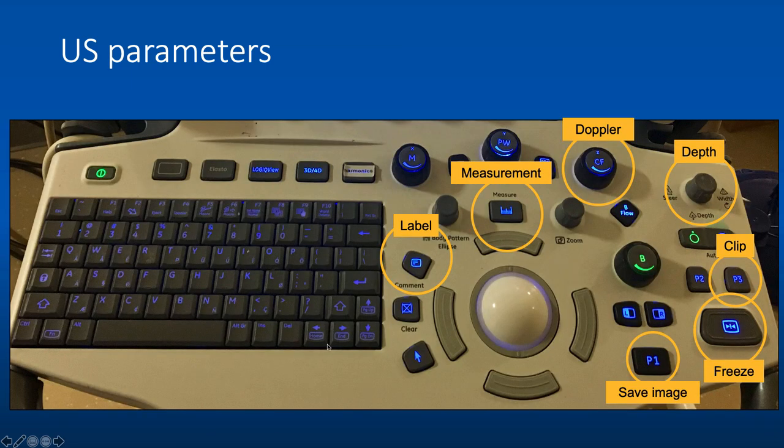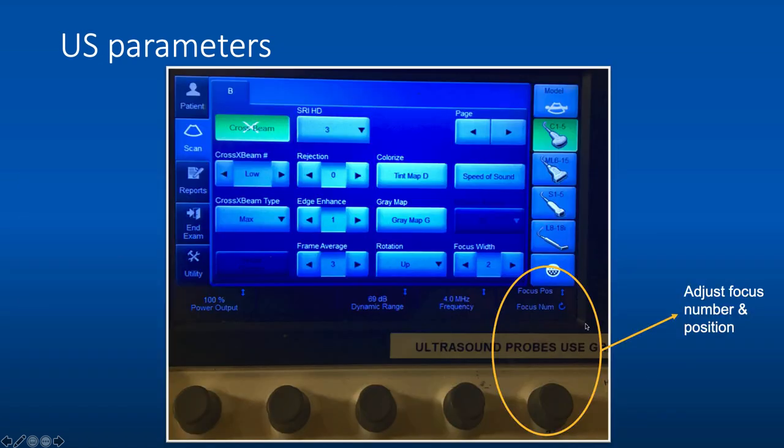Here are some important buttons: this button labels images; this button performs measurements; the Doppler button assesses for blood flow; pushing this knob up and down changes image depth. To perform a cine clip, hit P3 then take the image you want. For a single still image, hit freeze then save. On the upright part of the machine, you can adjust the number of focal points by twisting the knob, and push the knob up and down to change the position of the focal points.